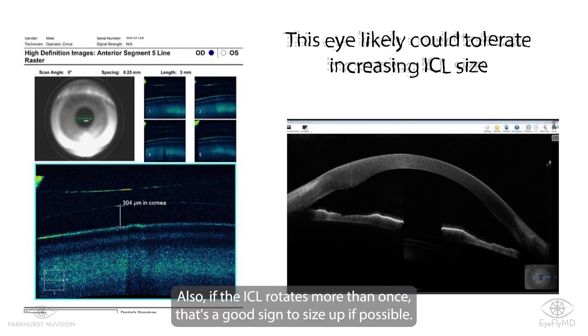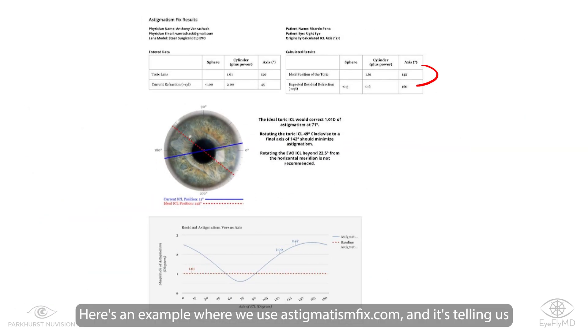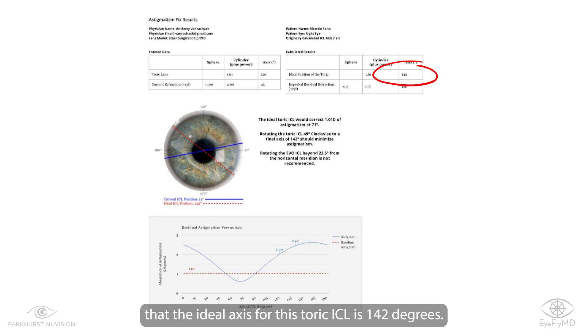If the ICL rotates more than once, that's a good sign to size up if possible. Here's an example where we use astigmatismfix.com and it's telling us that the ideal axis for this toric ICL is 142 degrees.